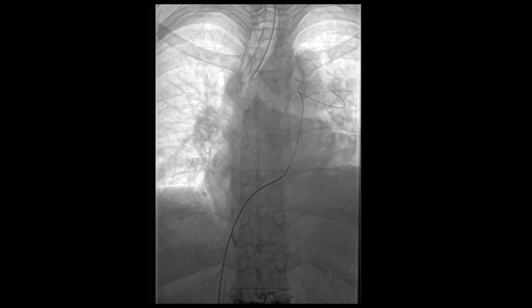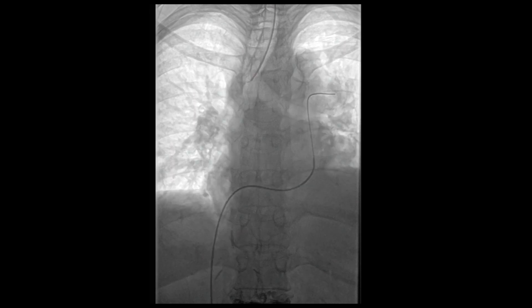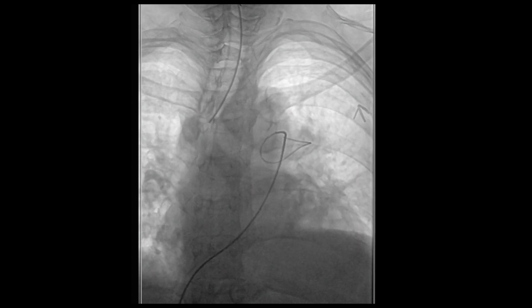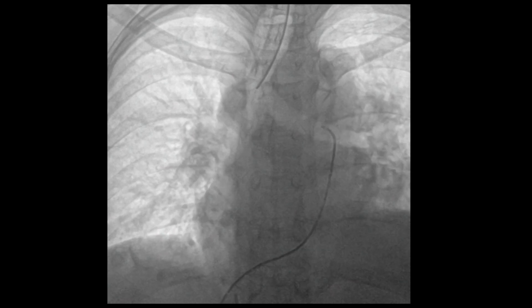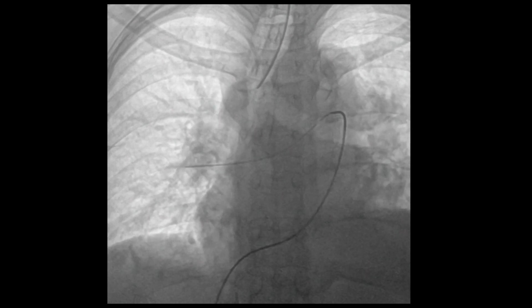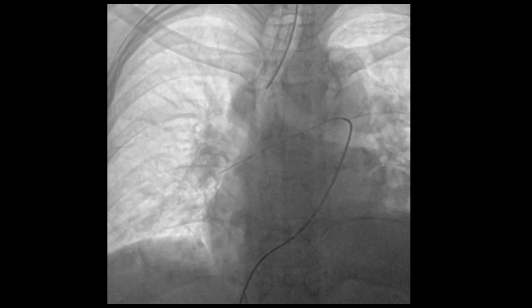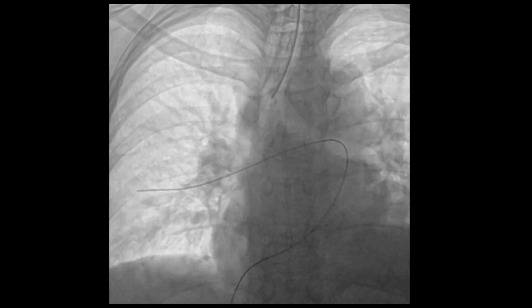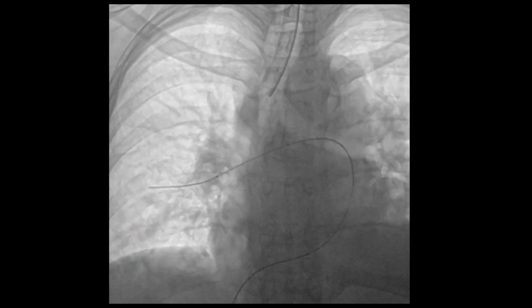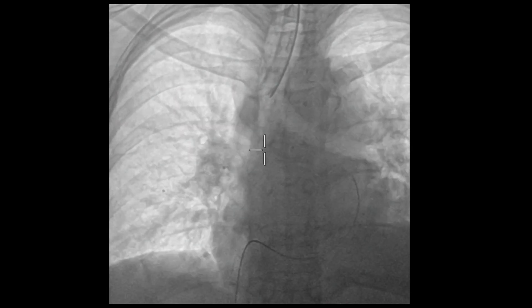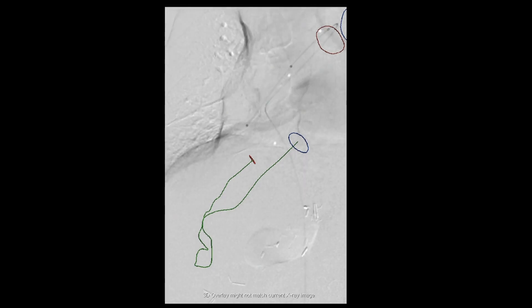Once the wire was advanced into the main pulmonary artery, the catheter was advanced over the wire. We then selectively cannulated the right main pulmonary artery and the wire was advanced into the right lung pulmonary arteries. A quick-cross catheter was then introduced into the pulmonary arterial circulation to exchange for a stiffer wire. A pulmonary angiogram was then performed through this catheter to confirm catheter position in the pulmonary arterial circulation.